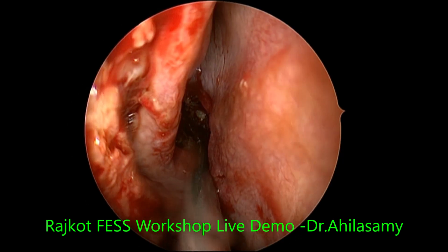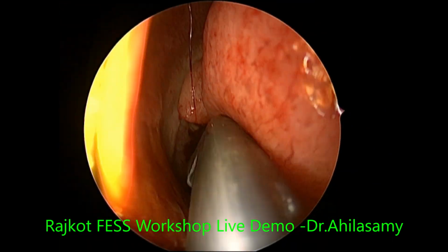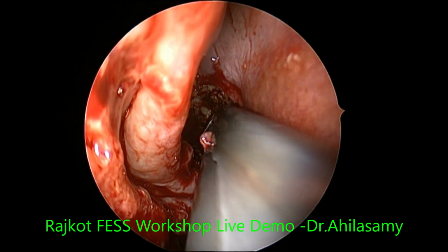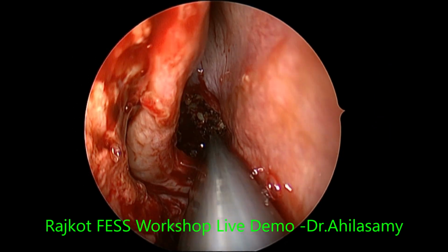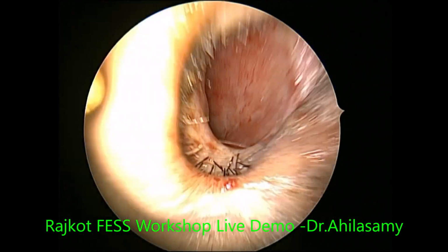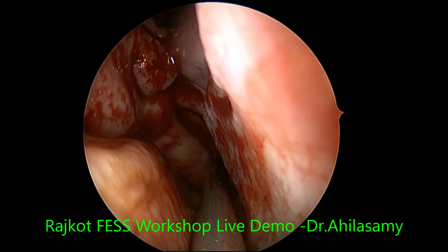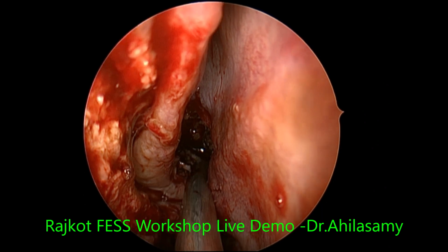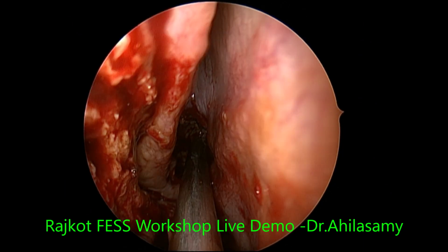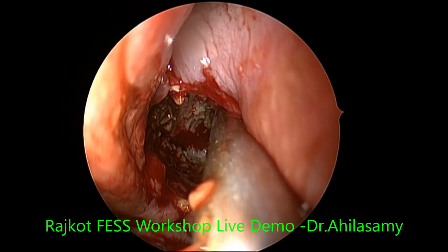Give me the Kerrison once again. I will be finishing the show in another 10 to 15 minutes. Please get ready for the next case for Dr. Tulasidas, that is septorhinoplasty. The patient is loudly snoring. So you should get ready. Slow down, madam. You should have slowed down. You gave a lot, now he is snoring.